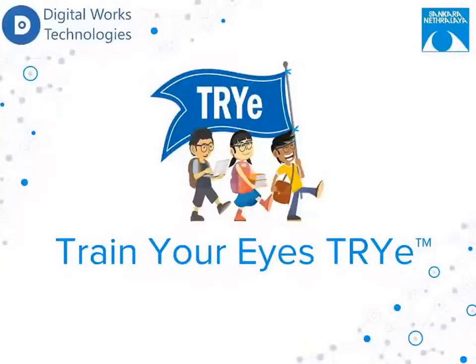TRYe, the new vision therapy software. I'm going to go through a few scenarios and you will find yourself fitting well into any one of them.